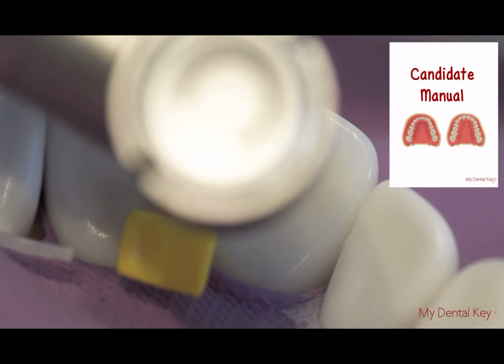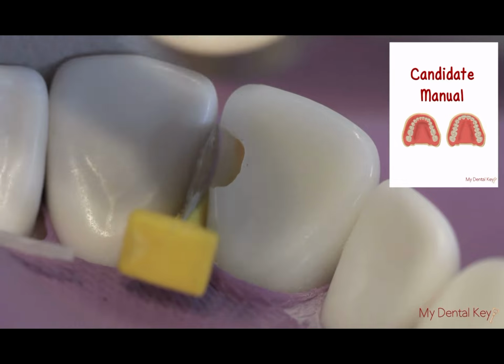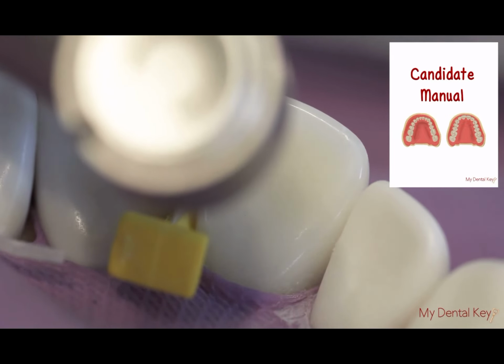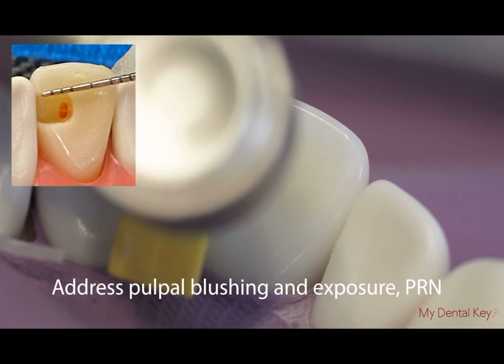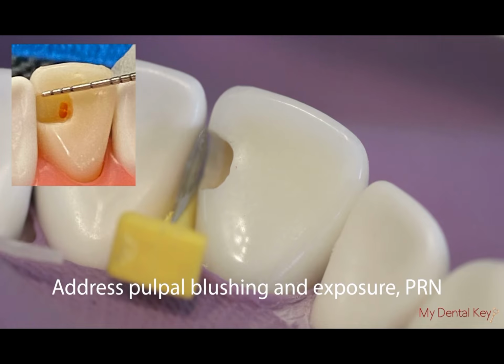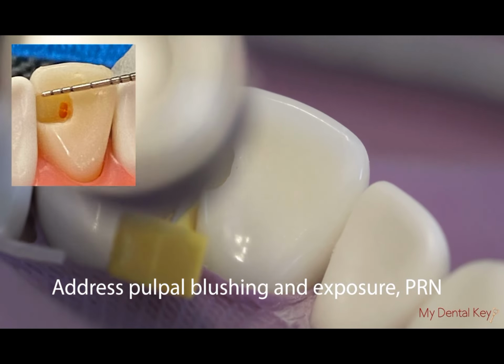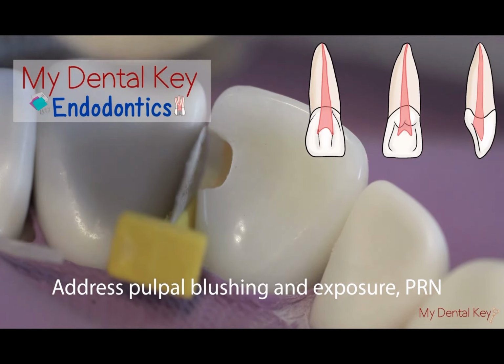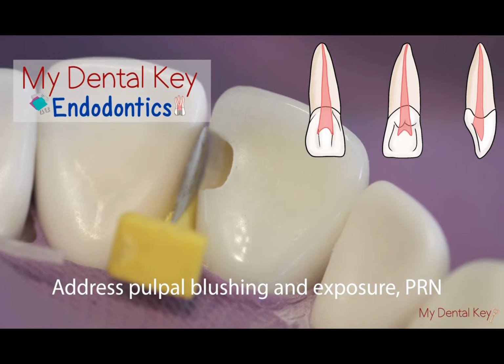Before your exam date, refer to the candidate manual to identify the successful criteria and the failure criteria for each preparation. Become familiar with the candidate manual on how to treat pulpal exposure or blushing. Refer to the My Dental Key endodontic section to see the pulp location and note that the pulp is usually in the center of this tooth.